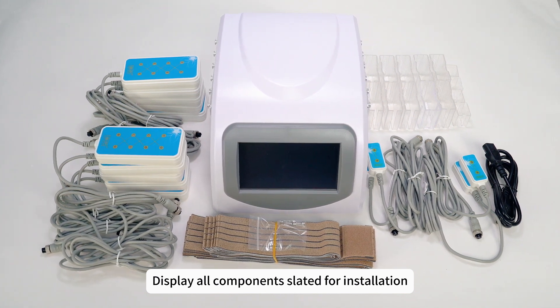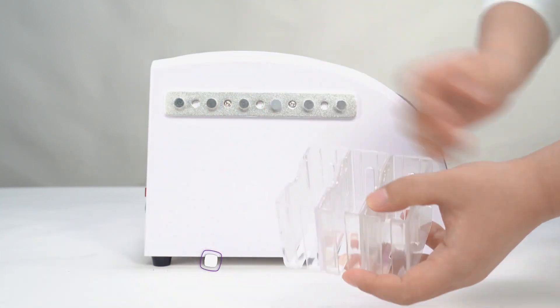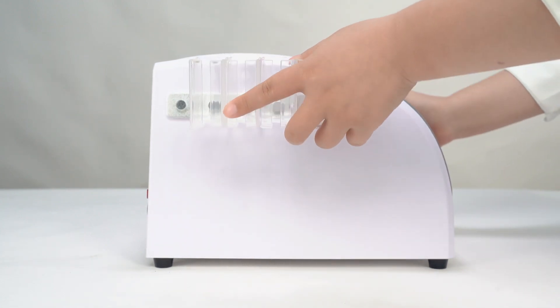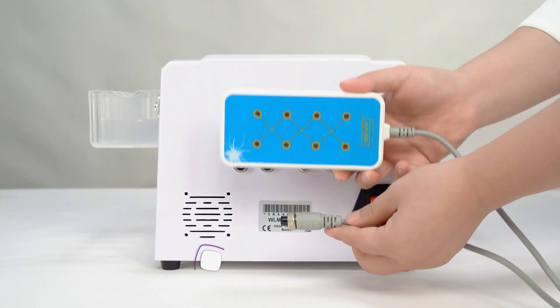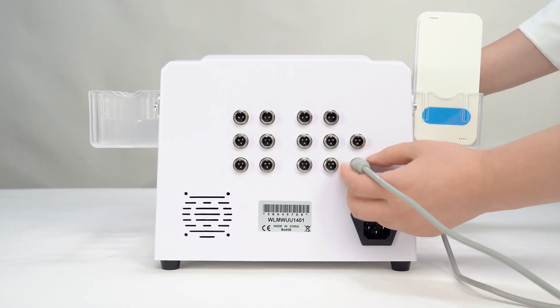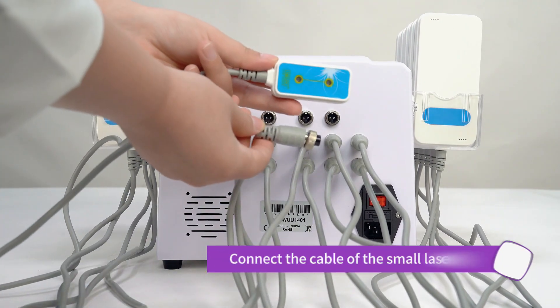Display all components slated for installation. Install the holder. Connect the cable of the large laser pads. Connect the cable of the small laser pads.